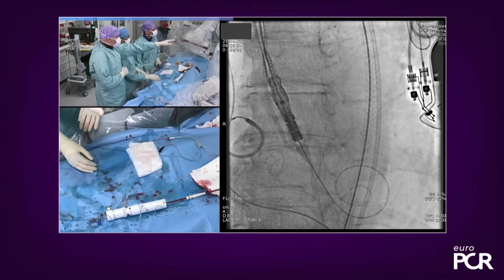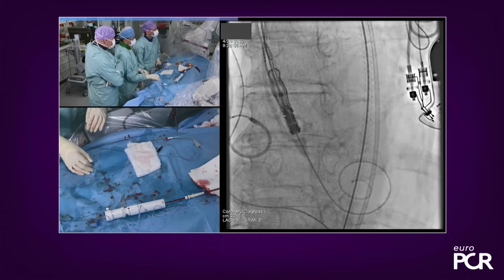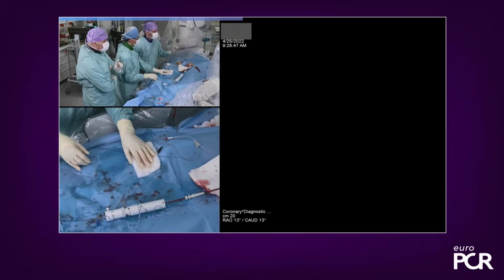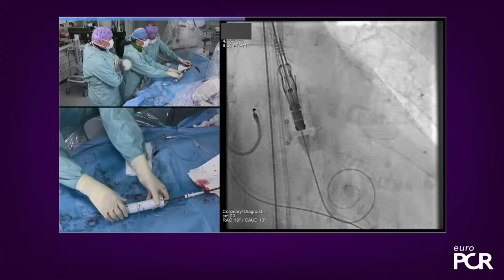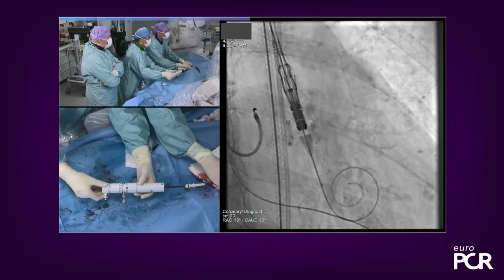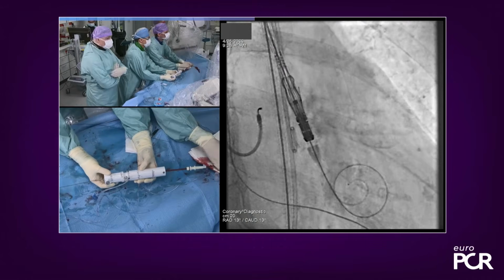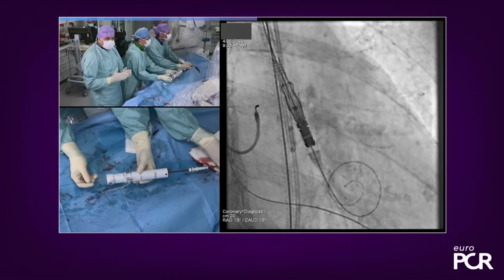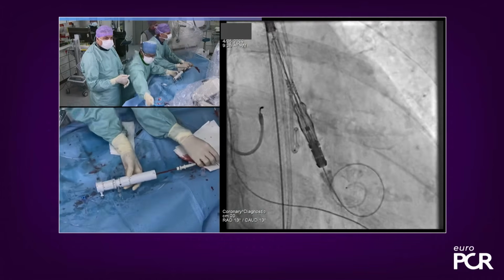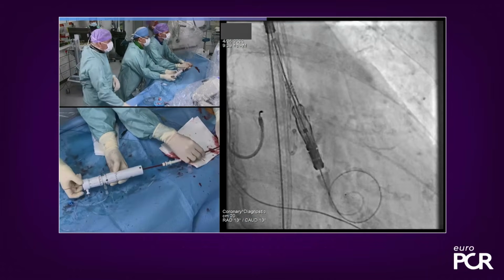Here, you see that radiopaque dot in the middle of the stent. If you look just on the left-hand side, you see one stent post is there. Yeah. So we need to bring one of the 3 stent posts by itself on the right-hand side, again in a right-left cusp overlap view. And you see it's actually pretty close to it. And also if you look at the post a little bit higher up, you see one is isolated on the right-hand side and the 2 others are overlapping on the left-hand side. So this is patient-specific commissural alignment. So it's not only depending on how you introduce your flush port at 6 o'clock, but you're going to do a fine-tuning in this right-left cusp overlap view.